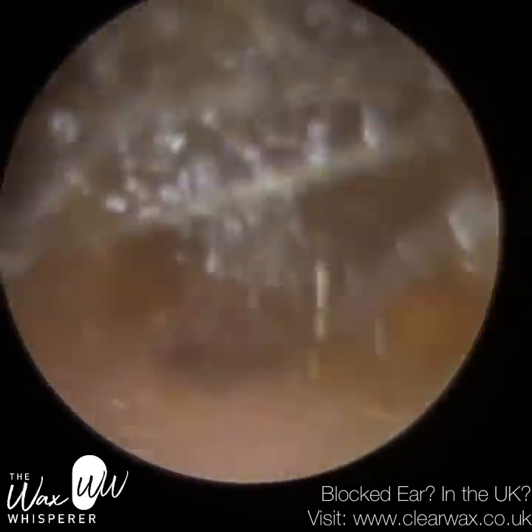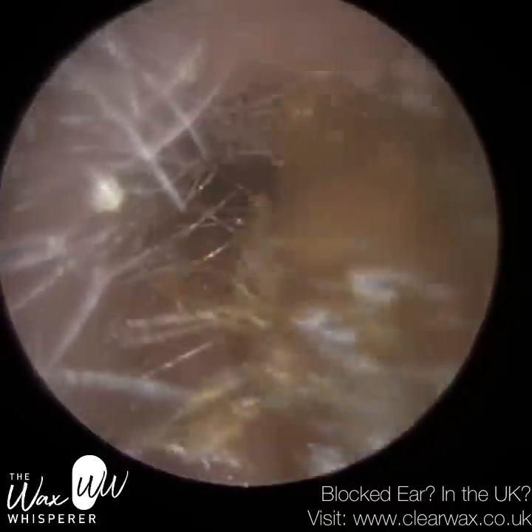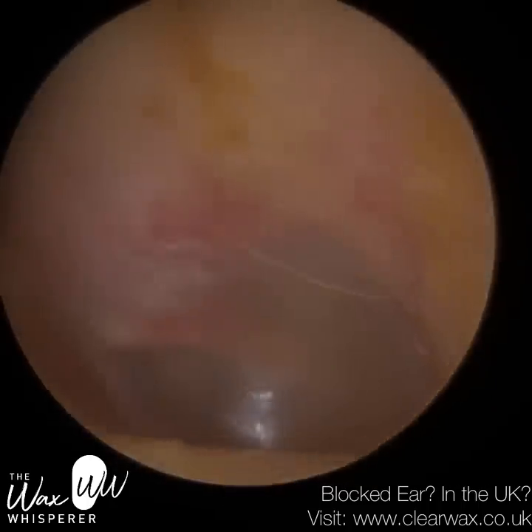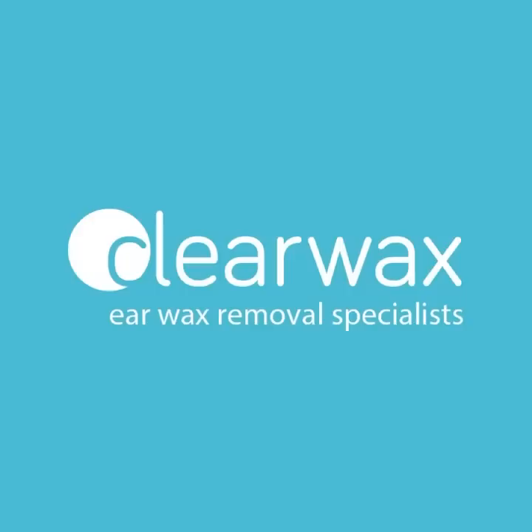You can see this ear came out far easier — the wax and skin was a lot firmer, so it came out in big chunks. This ear is also a bit more narrow and bendy, with a prominent second bend. The eardrum is nice and healthy. Well, I hope you enjoyed that video. Do take care, keep well, and speak soon. Bye.